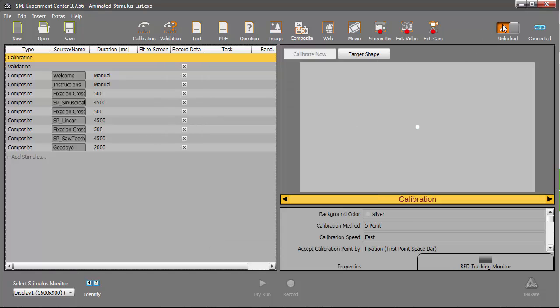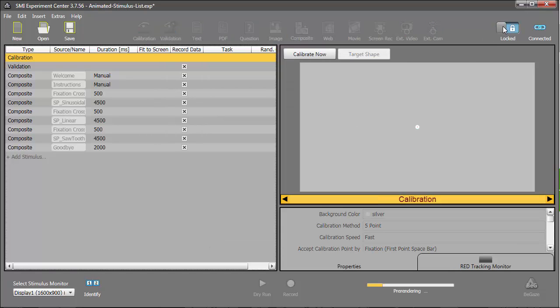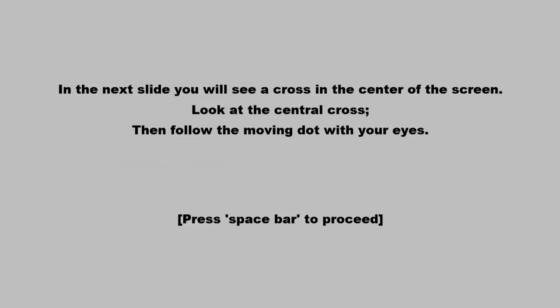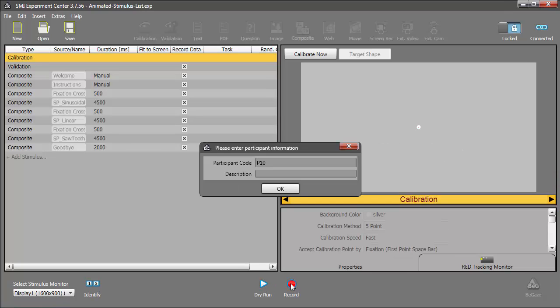I'll quickly save the experiment, lock it, and then do a dry run so you can see it in action. The introductory text is followed by the stimulus targets. Now, I'm ready to run it.